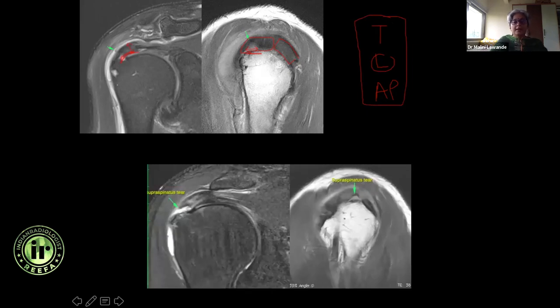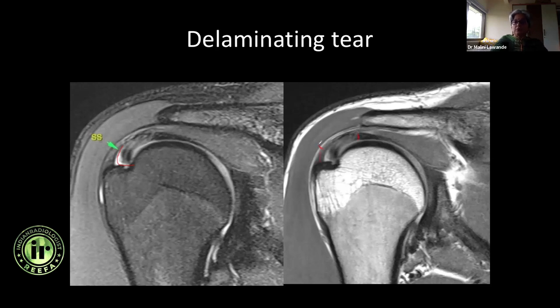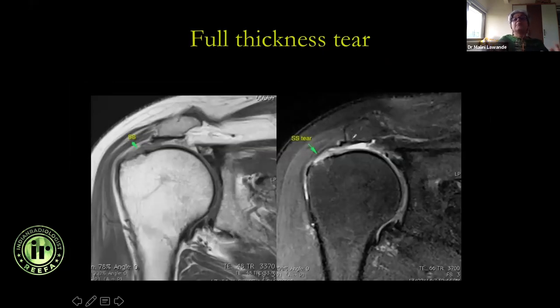Here I have a near full thickness bursal surface supraspinatus footprint tear. Also tell how the tendon looks — this tendon already shows moderate tendinosis. This is the infraspinatus, this is the supraspinatus, so this is at the posterior footprint. The AP dimension is maybe 4 millimeters with about 3 millimeters retraction. Sometimes you may have a delaminating tear — the tear started at the articular surface and then gone interstitial. Give both extents because the superficial and deep fibers may be retracted to different levels — the surgeon needs to know both.